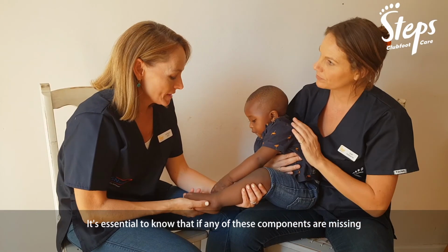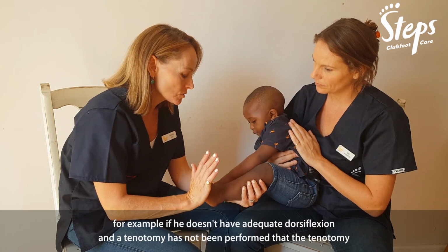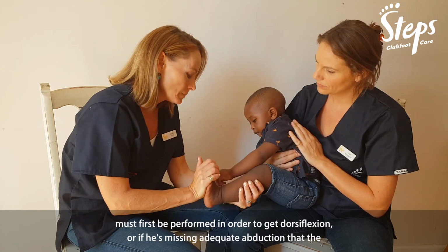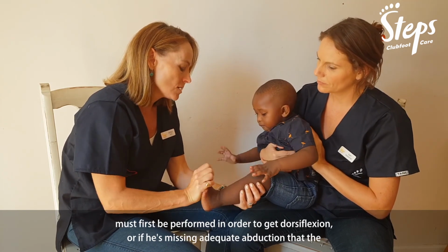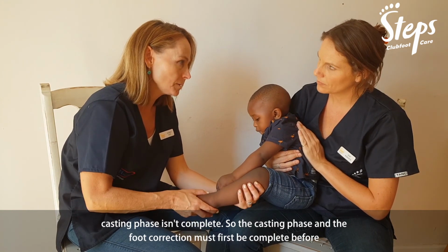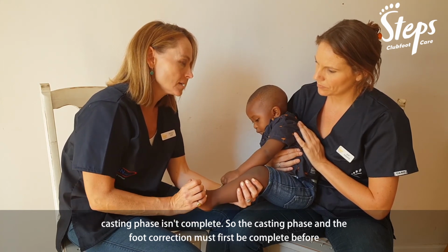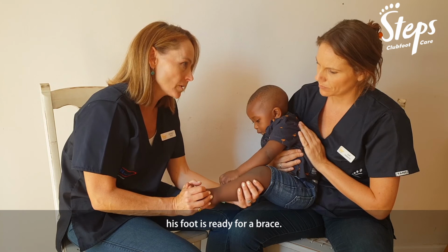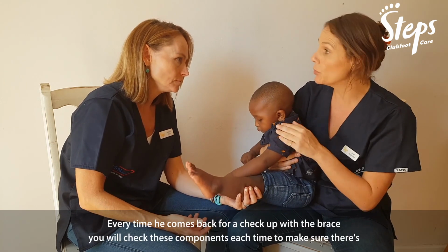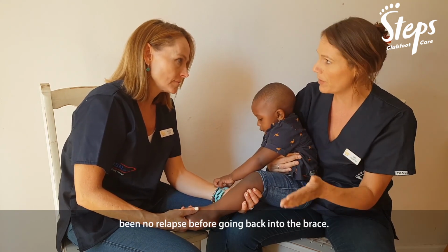It's essential to note that if any of these components are missing, for example, if he doesn't have adequate dorsiflexion, and a tenotomy has not been performed, then the tenotomy must first be performed in order to get dorsiflexion. Or if he is missing adequate abduction, the casting phase isn't complete. So the casting phase and the foot correction must first be complete before his foot is ready for a brace. So every time he comes back for a checkup with the brace, you will check these components each time to make sure there's been no relapse before going back into the brace.